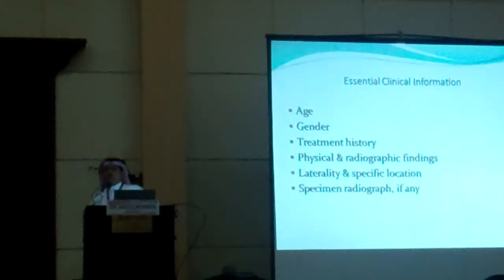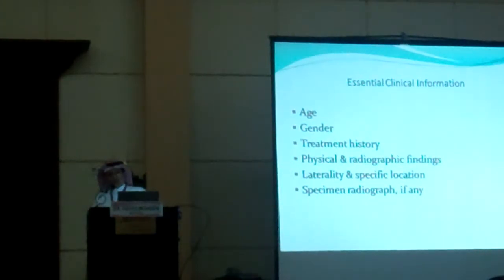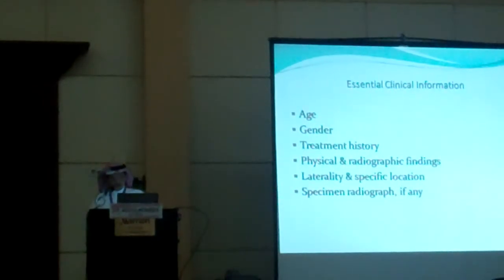If you have a specimen radiograph, we would like to know if there are radiographic findings also obtained from the specimen. If you don't have a facility to provide it to us in the system, tell us about the radiological findings in the specimen itself.